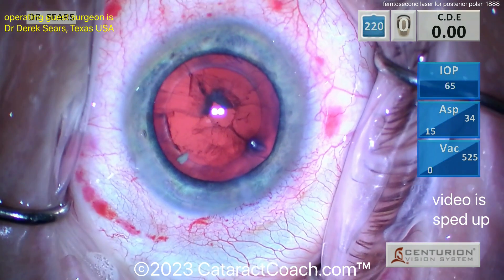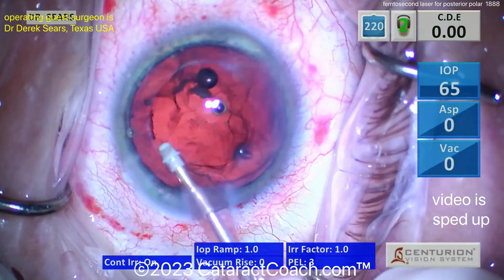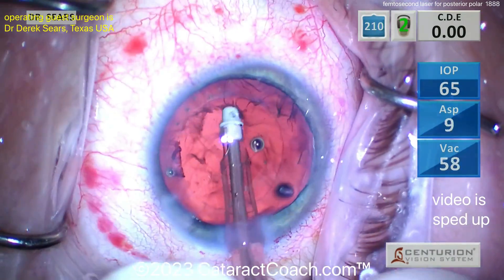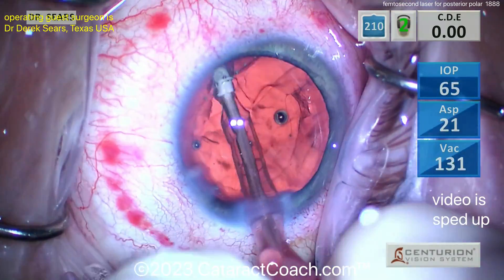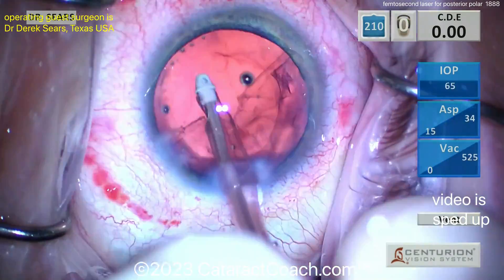You can see that posterior polar plaque has already popped off the back, so you don't see that anymore. But even then, that capsular bag back there can be pretty wimpy — I'd be very cautious. So removing the cortex now, very nicely done.